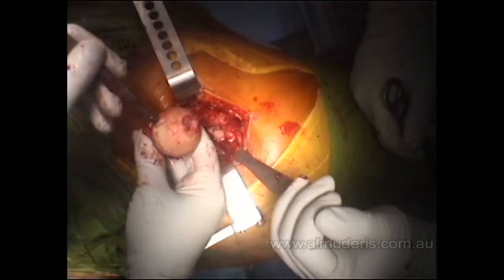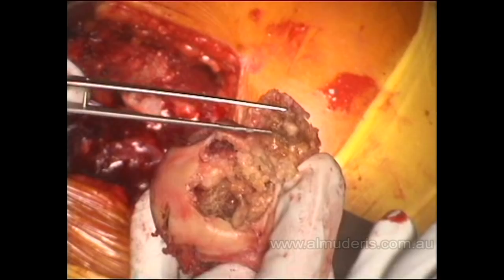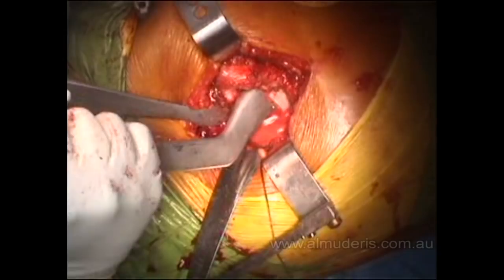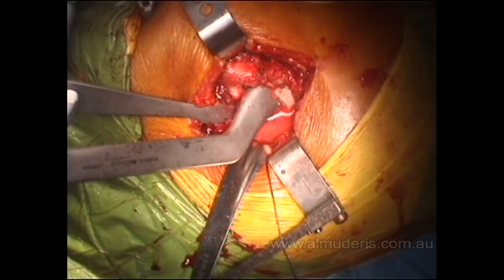Imagine a patient weighing around 70 kilograms putting their whole weight through this area. Removing the necrosed area — that is all dead bone underneath. This is an area of avascular necrosis and you can see it is very soft. After reaming, we start broaching. One has to be very careful when broaching a very tight canal not to fracture. The broach is solid in the canal and then the real implant is inserted.